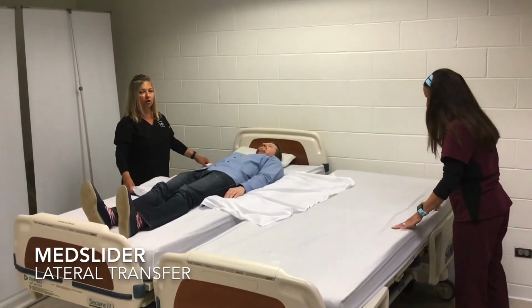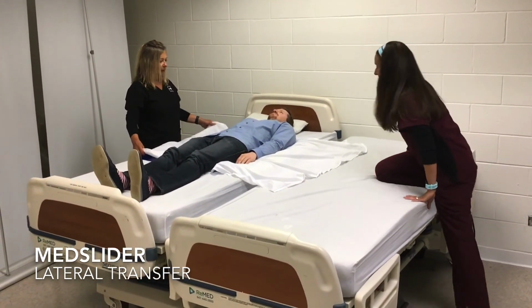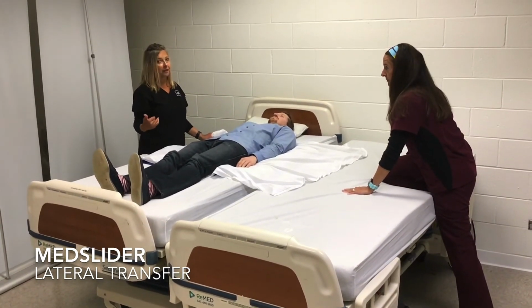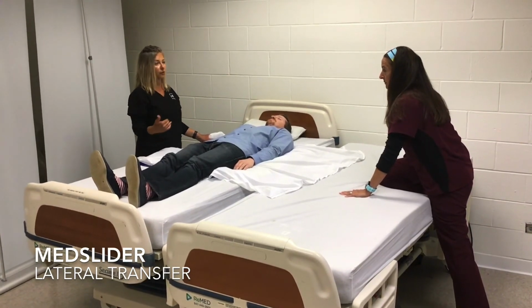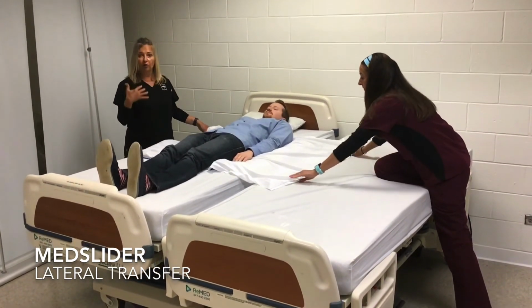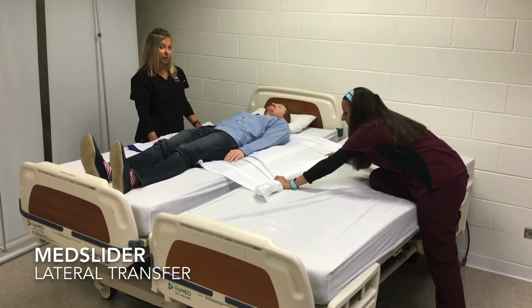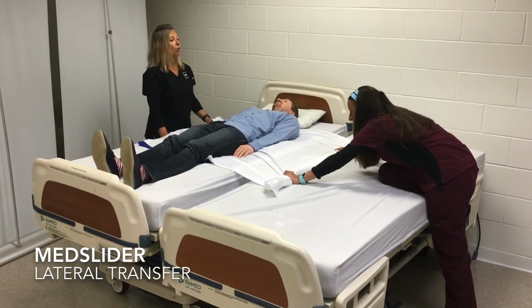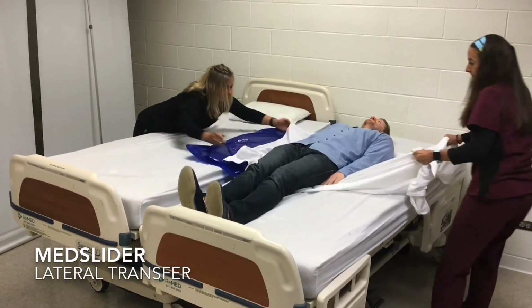Okay, so we're now going to show you how easily this is done. So our patient is lying in the bed. We have 2 nurses. Now please refer to your facility guidelines as to the proper number of assistants that's needed for this type of procedure. For this video, we're going to show 2 clinicians. So we're going to laterally transfer the patient from one surface to another on the count of 3. 1, 2, 3.